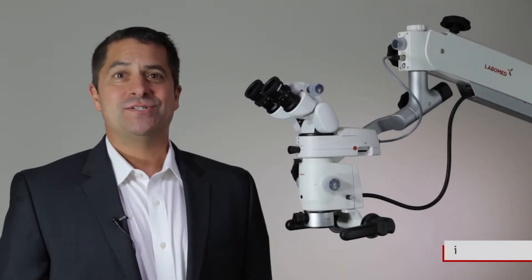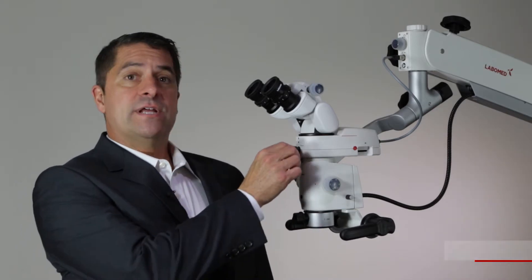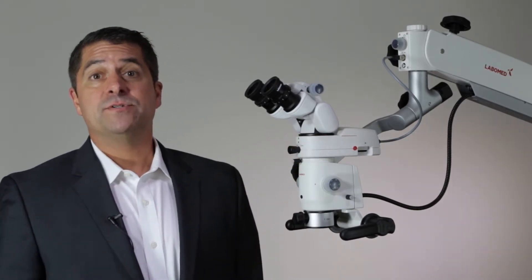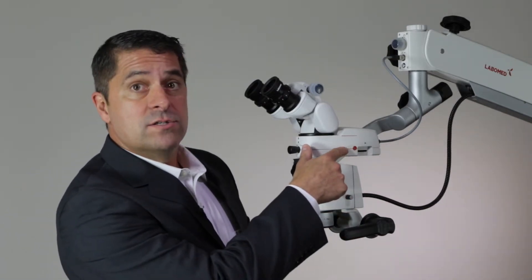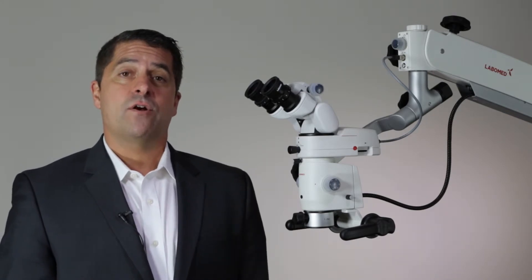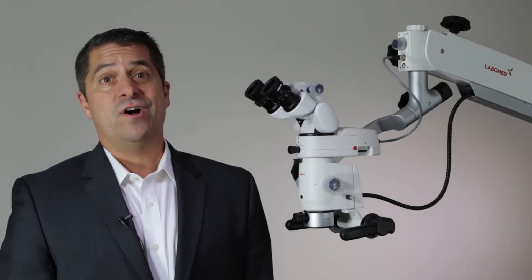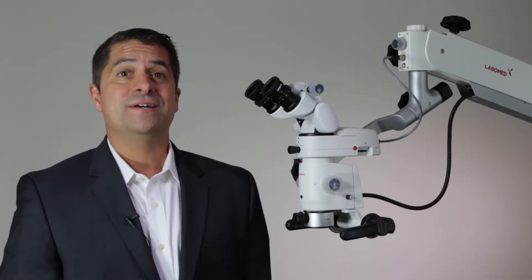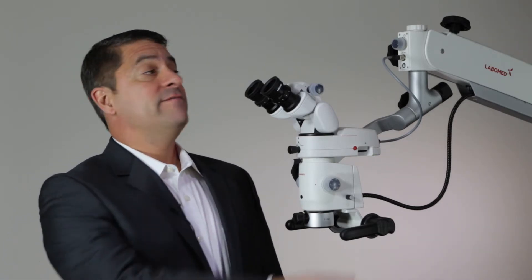Also included in the ProLine series is our iView S5 camera with integrated beam splitter and an iris diaphragm to improve light sensitivity and contrast. Output options include 1080p streaming through HDMI, an SD card slot for on-device capture, and a USB connection for accessing our powerful Pixel Pro capture software. This is an all-in-one camera that maintains the microscope center of gravity as a unique inline solution. Each microscope is pre-wired with power for the iView S5 with this convenient power connector.